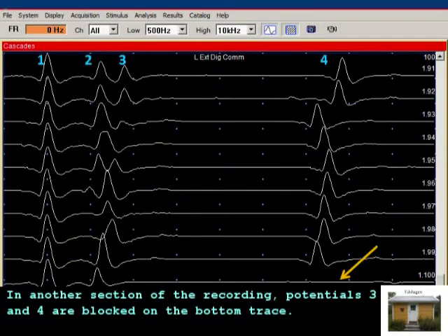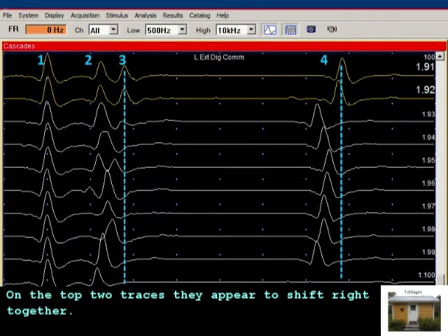In another section of the recording, potentials 3 and 4 are blocked on the bottom trace. On the top two traces, they appear to shift right together.